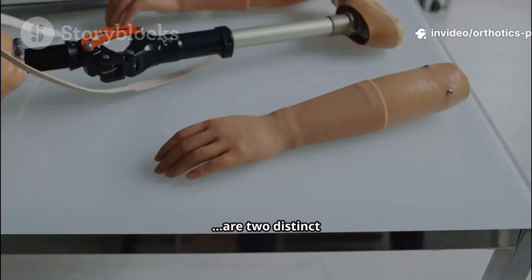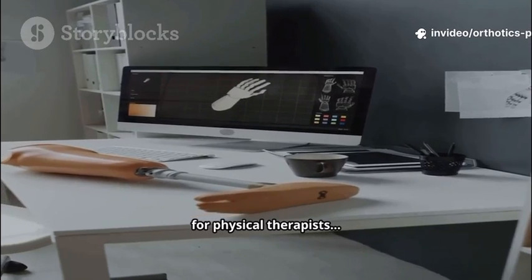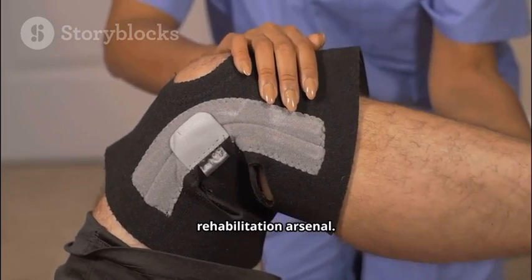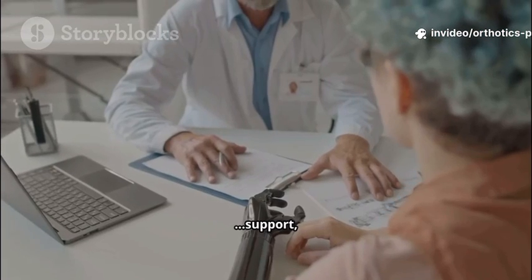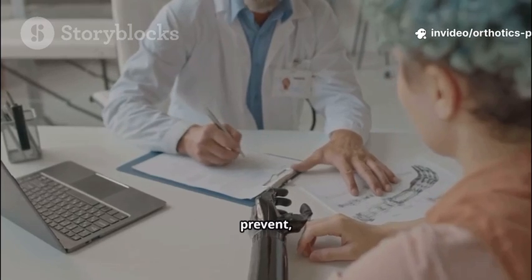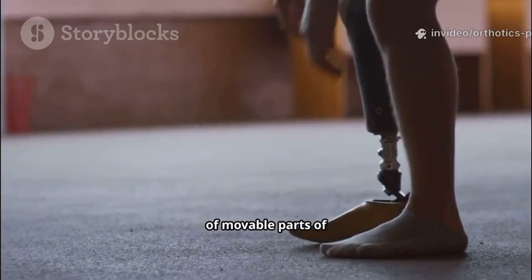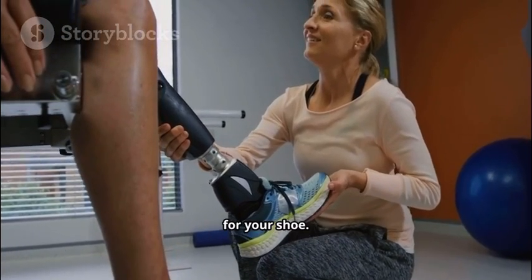Orthotics and prosthetics are two distinct but related fields. Both are crucial for physical therapists, and they represent powerful tools in our rehabilitation arsenal. Orthotics are external devices. They're used to support, align, prevent, and correct deformities. They can also improve the function of movable parts of the body. Think of a brace for a sprained ankle, or a custom insole for your shoe.